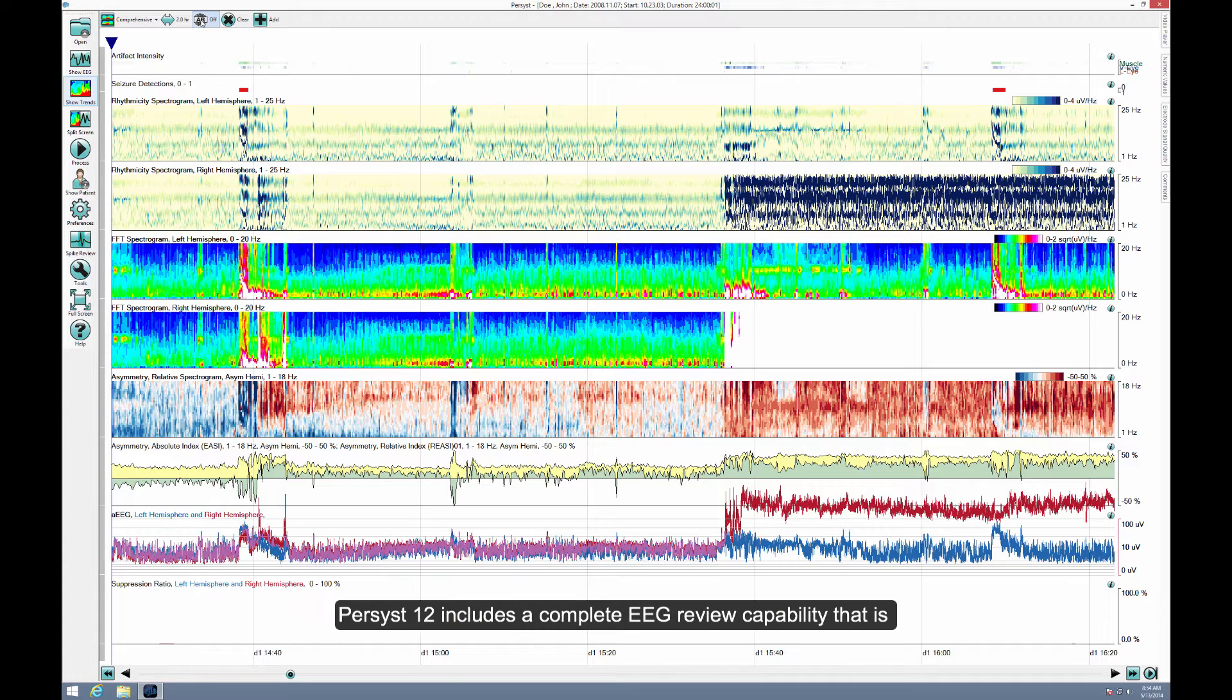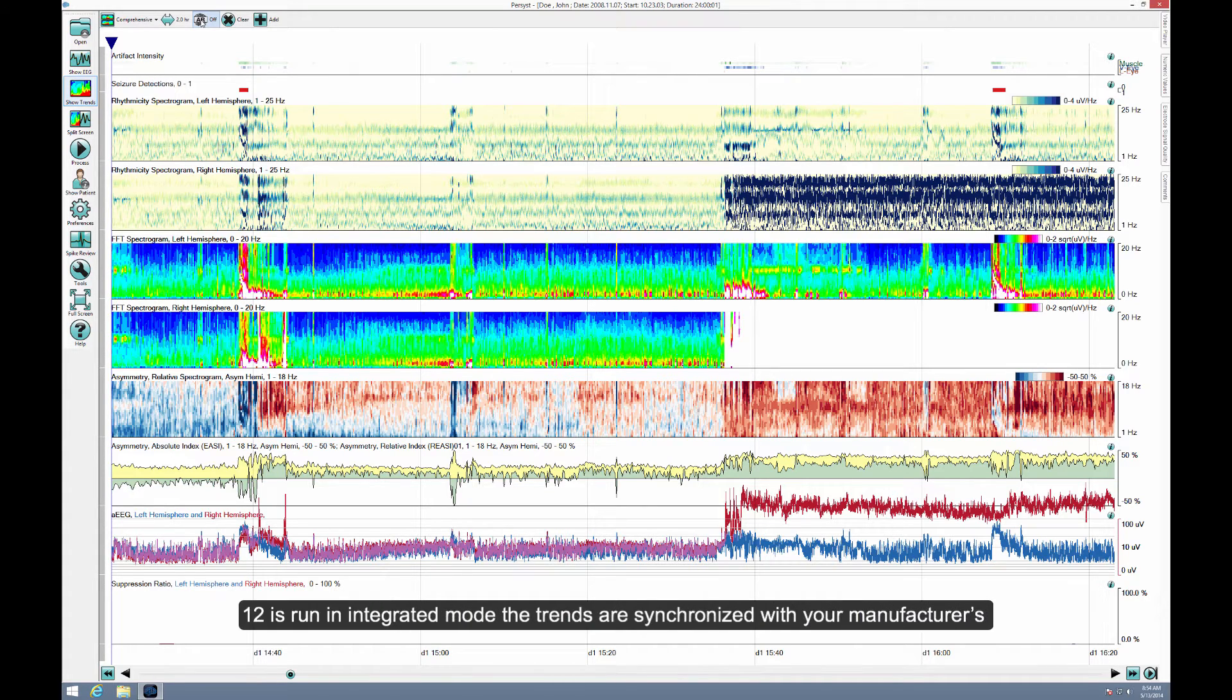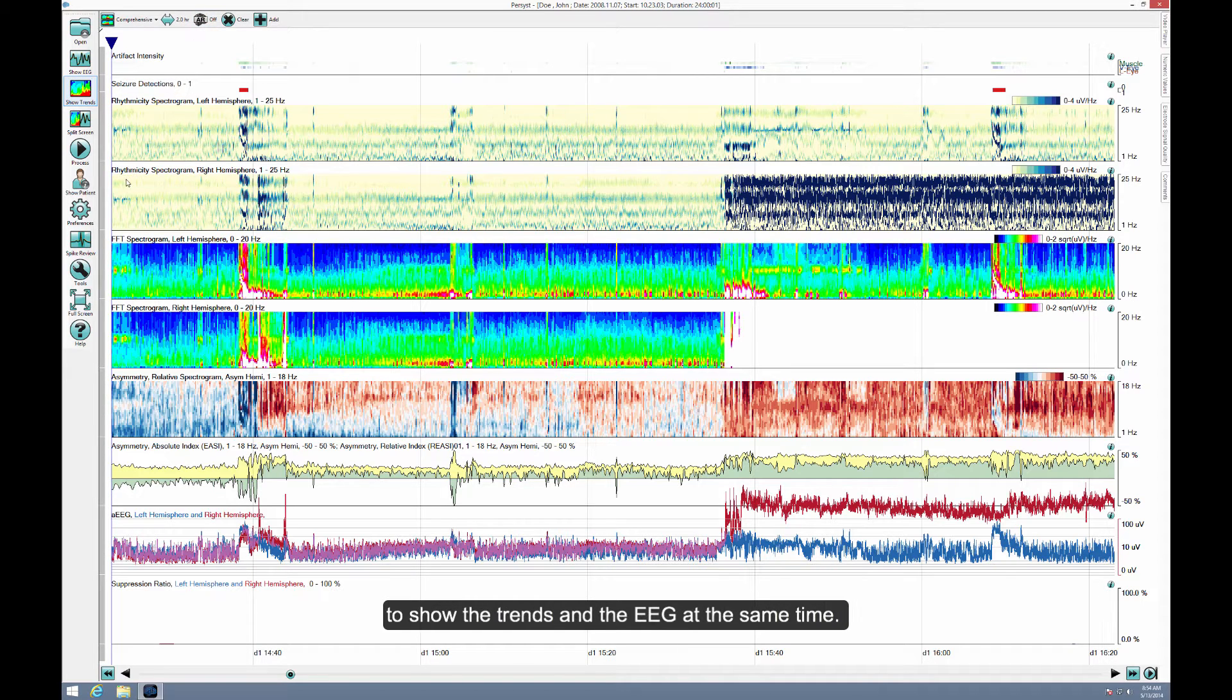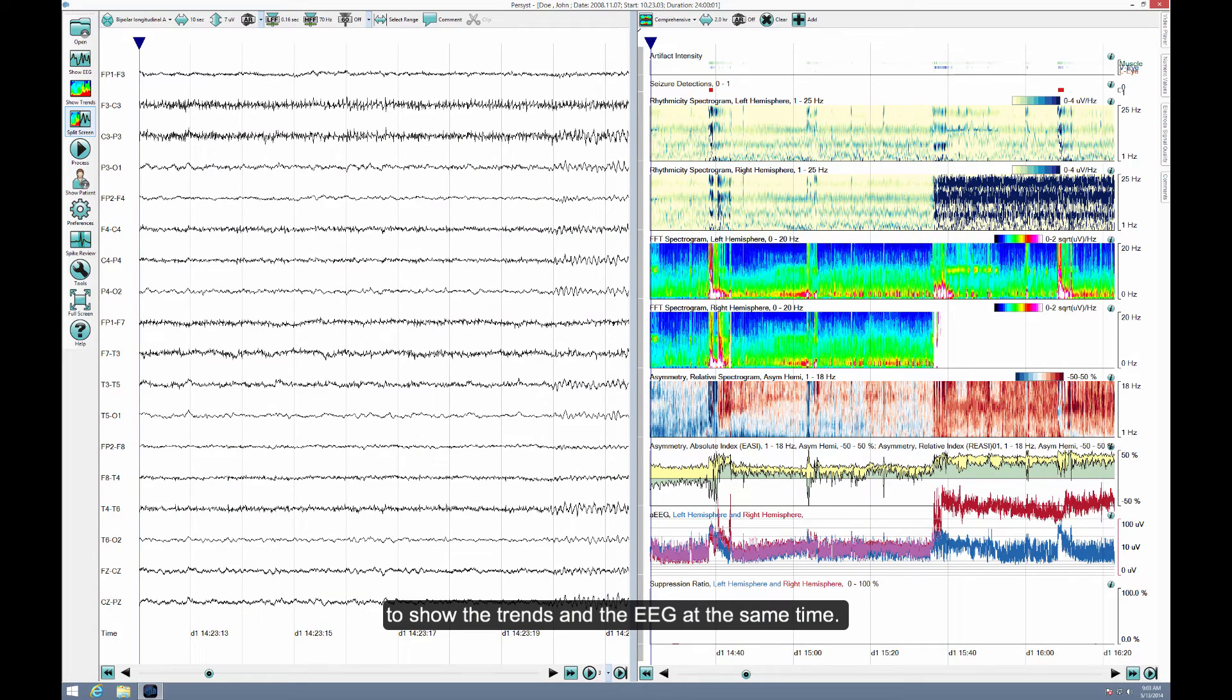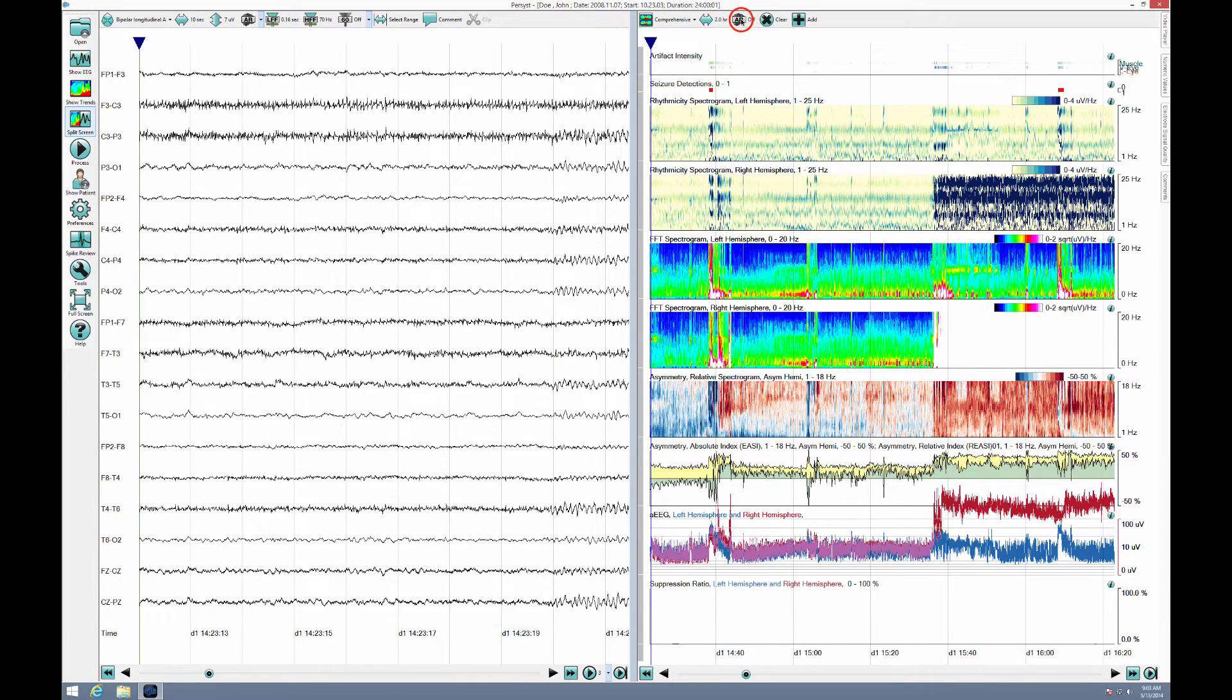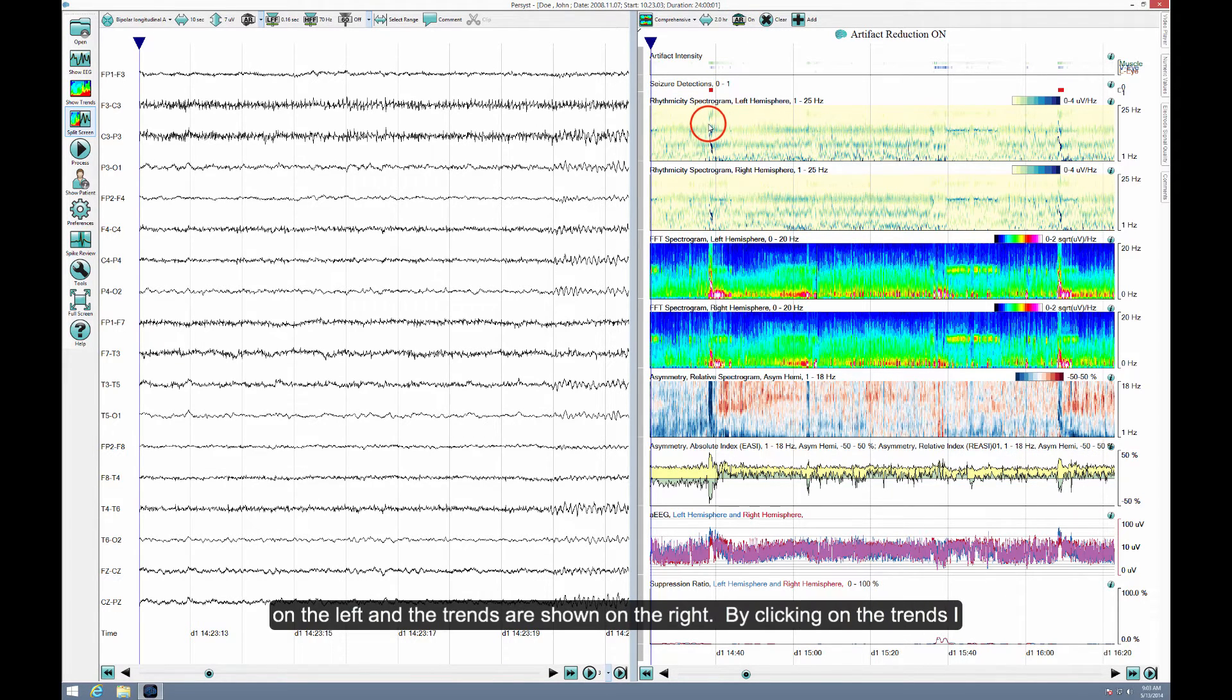Persyst-12 includes a complete EEG review capability that is synchronized with the trends. Also, when Persyst-12 is run in integrated mode, the trends are synchronized with your manufacturer's EEG display. I'll open a split screen to show the trends and the EEG at the same time. This is the mode that's usually used during EEG review. Now the EEG is shown on the left and the trends are shown on the right.